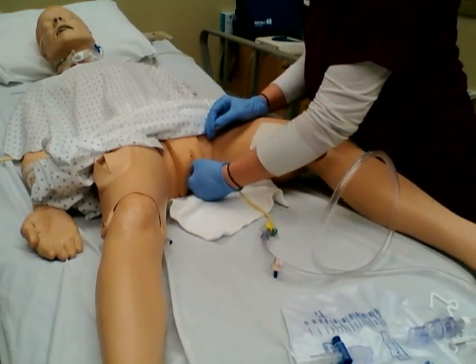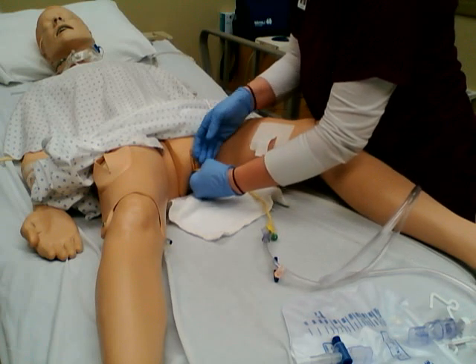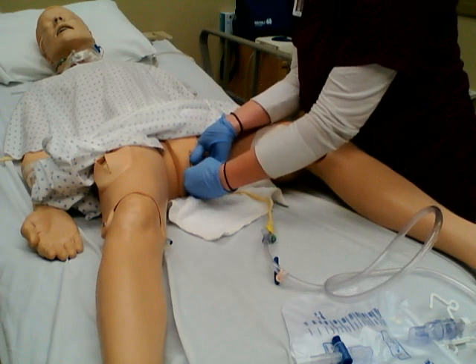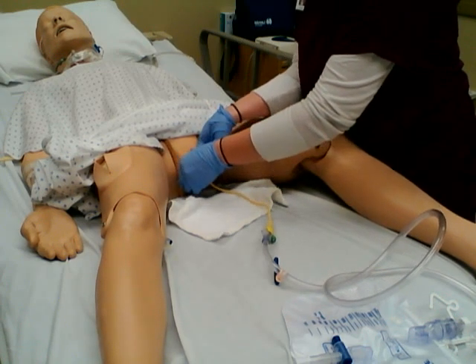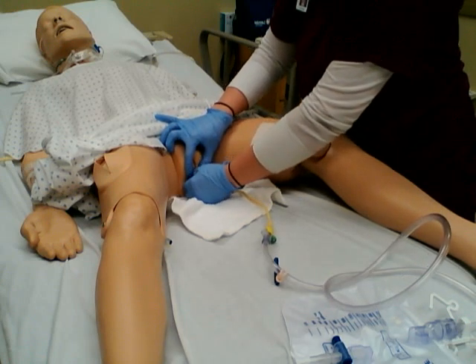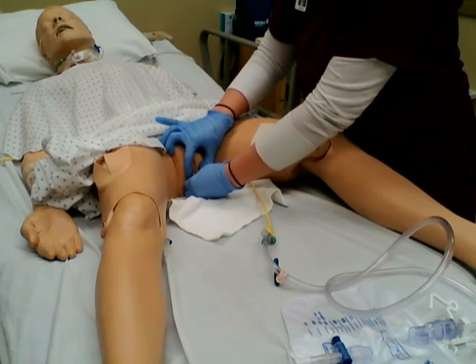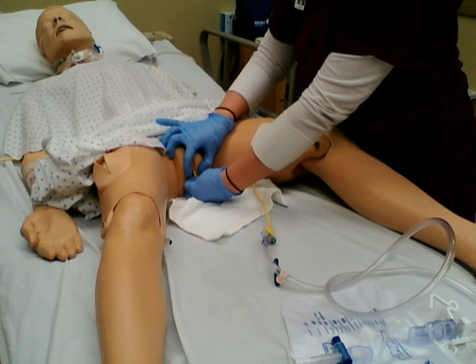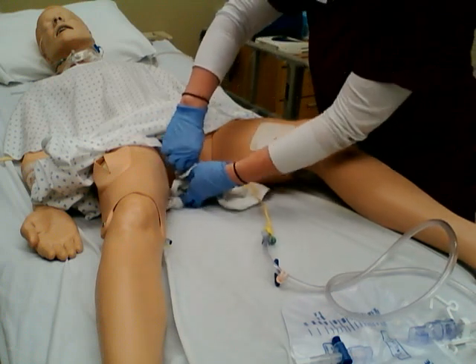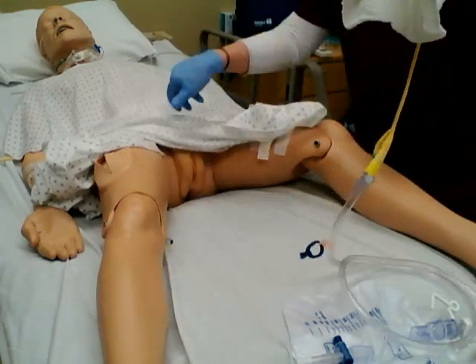And then you're going to pinch off and keep this at an upward angle. A good thing to remember about the catheter is to always keep it at an upward angle when you're inserting and when you're taking it out. And you want to just slowly remove that, keeping it pointed up, so that the patient isn't messy at all.